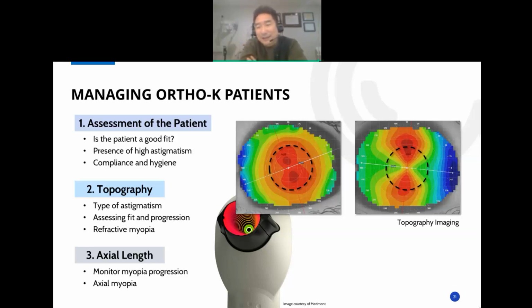When you look at the picture on the right-hand side, that's called limbus to limbus astigmatism. That one's harder. You can't fit a normal, typical spherical ortho-K. That lens will be moving left and right, up and down a lot. Those ones you have to create a toric ortho-K lens. And the magic number is 30 micrometers in sag height. When you're measuring using your topographer, there's a function that can check the height elevation difference between the flat meridian and the steep meridian. If it's more than 30 micrometers, usually you'll have to fit them with a lens that has an astigmatism design.